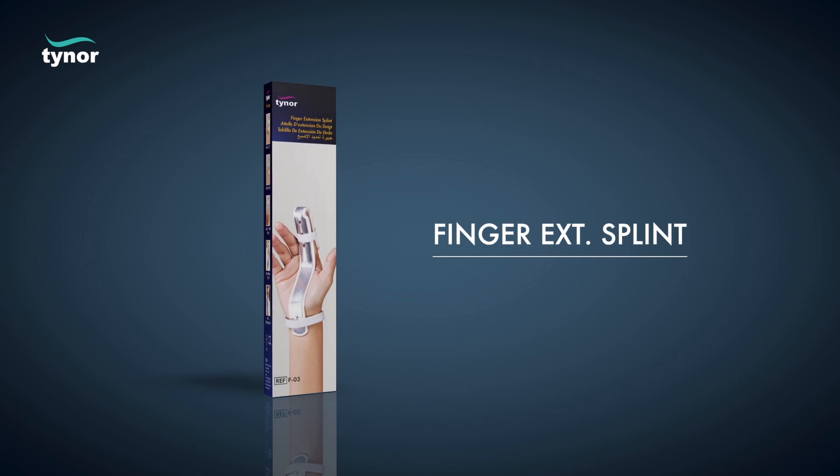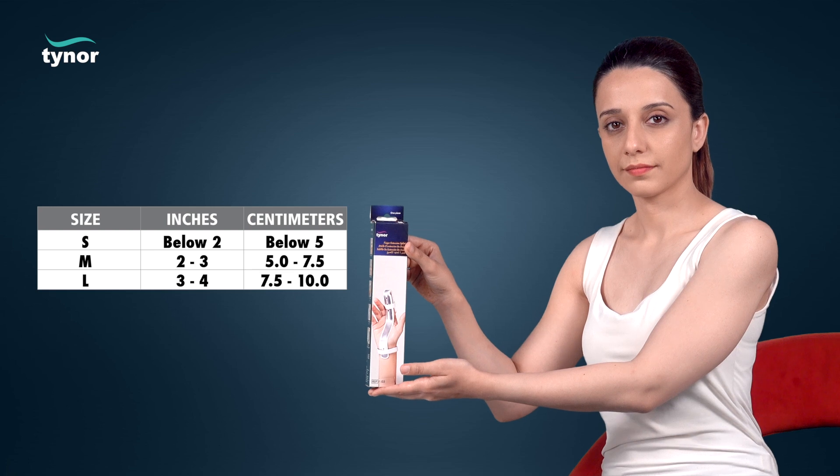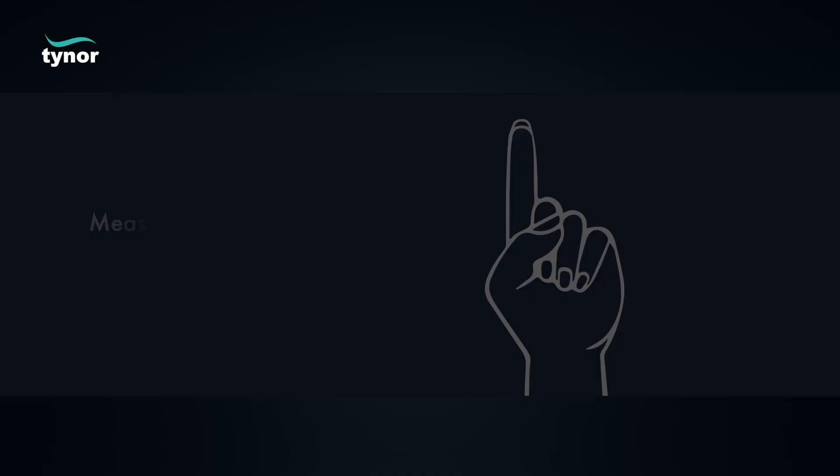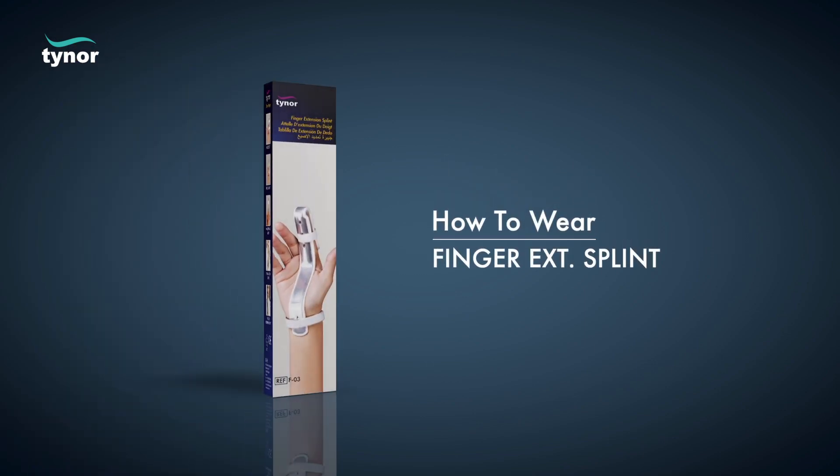Here we will discuss how to measure the size and how to wear the finger extension splint. The finger extension splint is available in these sizes. Measure the length of the finger.